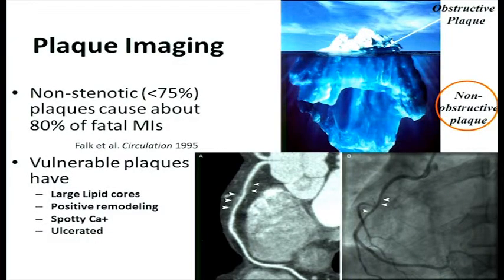The other thing which you want to see in the coronary artery evaluation is the plaque imaging. Like I said before, the catheter angiogram will just show you the lumen, it does not show you the wall. You can have a look at the wall in the CT. You can see the plaque on the CT but not on a catheter angiogram. So this is where the coronary CT angiogram scores over the catheter angiogram.